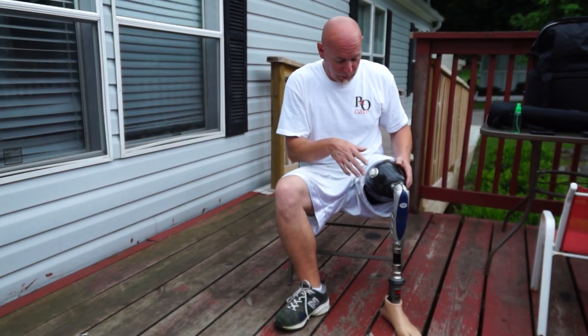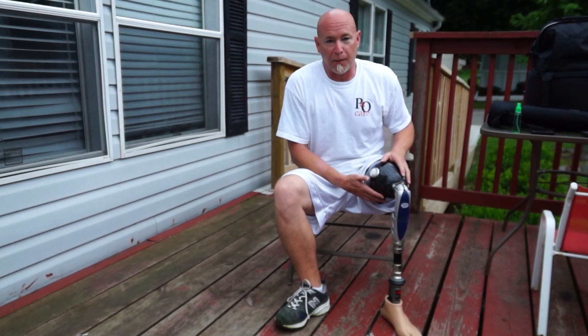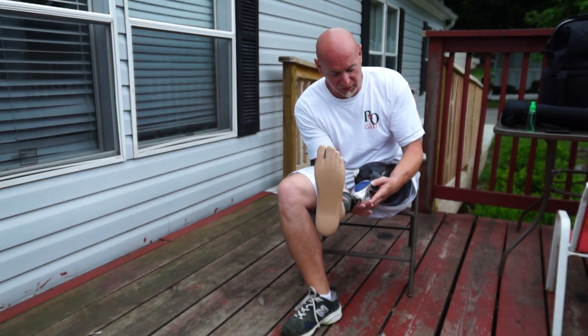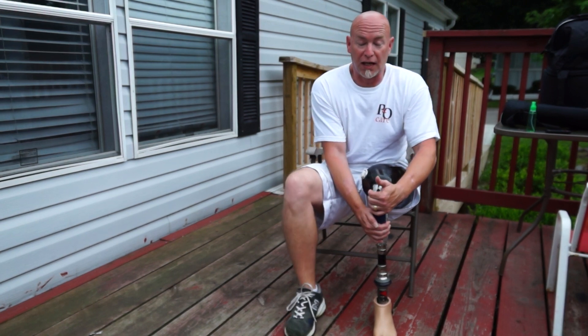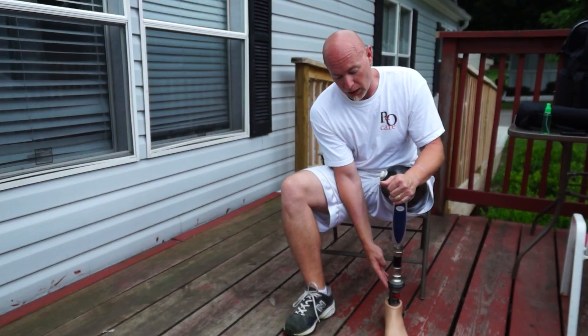I just want to explain a little bit about my leg. This is actually a carbon fiber socket. I have a 3R60 knee, which is a stance flexion knee. It's dual axis and I have a Triton Ottobock foot.